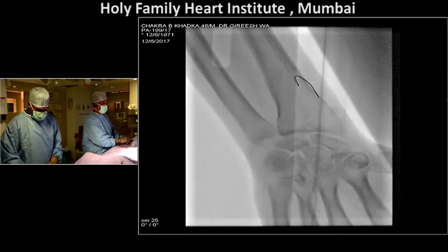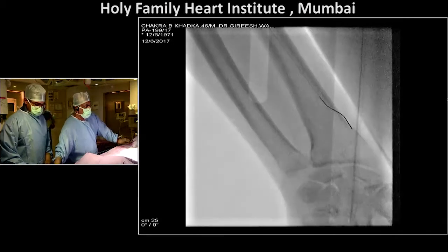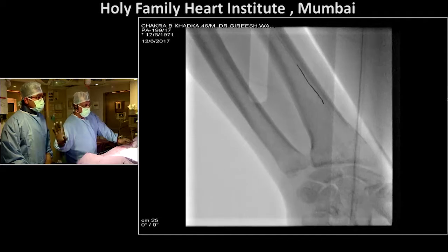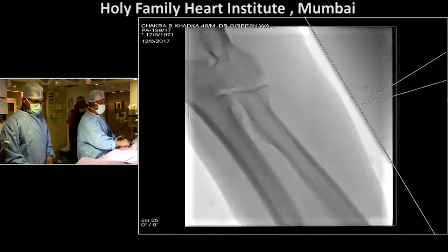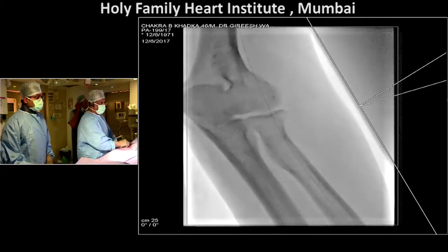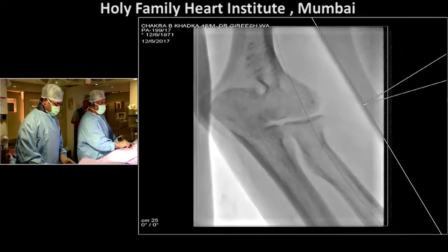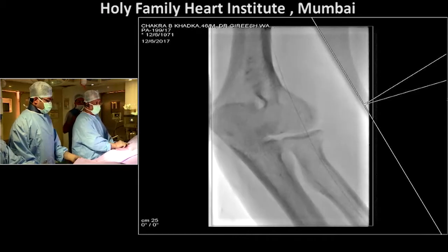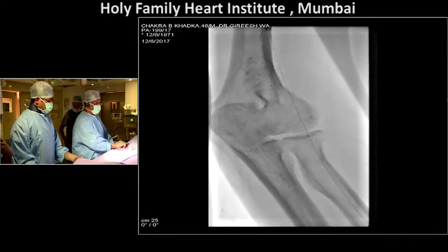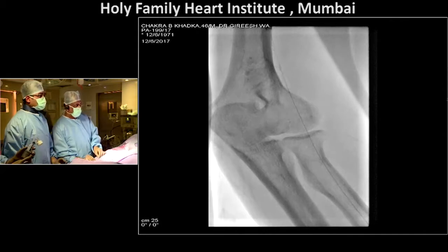Any questions in the audience or suggestions? If you have any experience with similar cases in your practice somewhere. Let me throw it out: in case you find an occlusion in the brachial artery but also an occlusion in the distal radial, what would you do? How do we handle that? Okay, so Gireesh, brachial artery occlusion as well as radial artery occlusion. Two segments. Tough call.